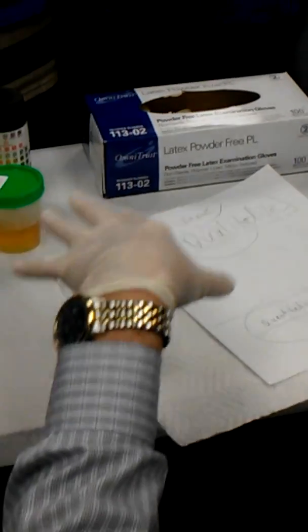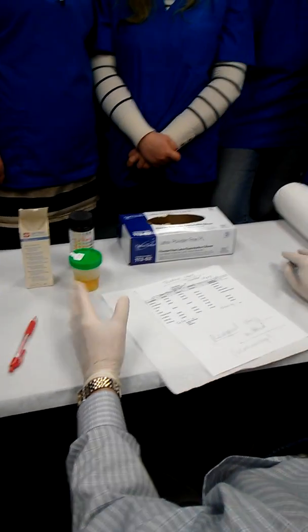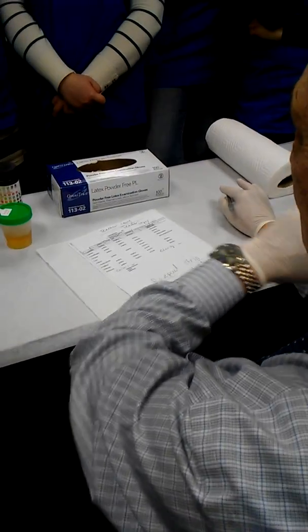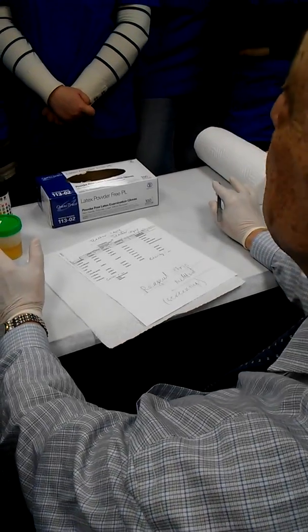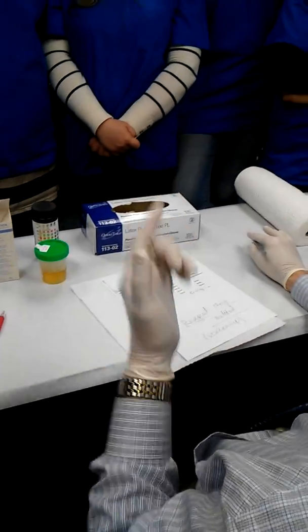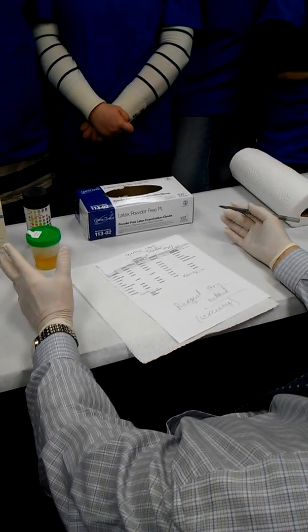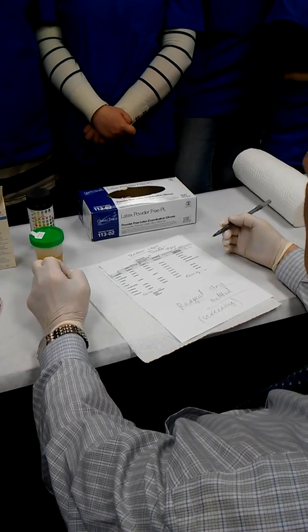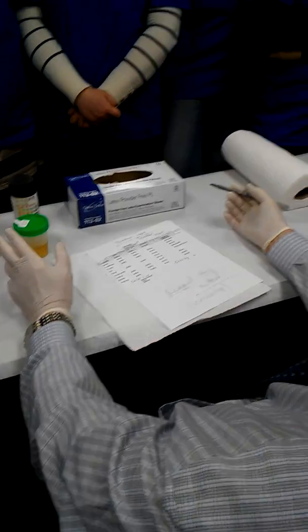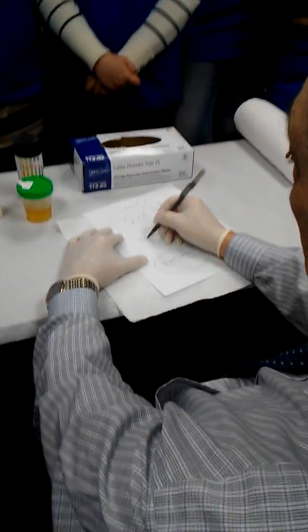So if you don't see anything here, we're saying the test is negative and it's good. And if the doctor is not telling you anything, you're not sending this test to the lab. But if you find something in the urine, for example, protein or sugar or something else, it means the test is positive. Positive means you found something in the urine. If you found something, the test is positive, you have to send it to the laboratory for confirmation. Clear? Confirmation.